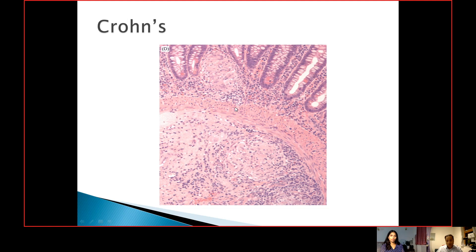This is the muscularis mucosa here. You can see on this power the crypts show very minimal crypt architecture distortion, and there is this patchy distribution of the inflammatory cells, and again this transmural granuloma here. In Crohn's disease, the inflammation is more deep.